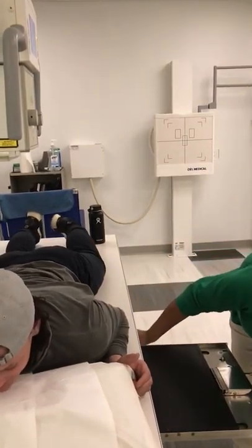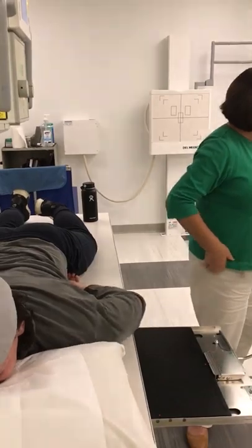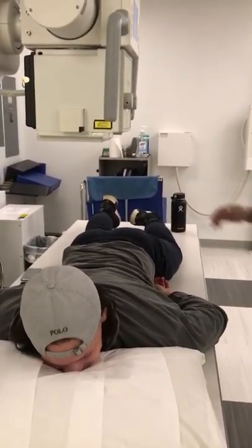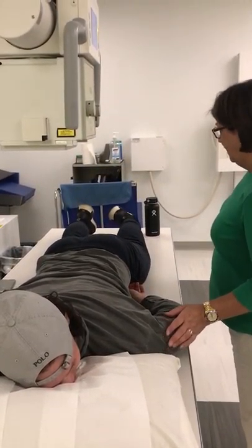I'm not that even. So I need to check that to make sure that the top of the IR is at the top of the shoulder, 2 inches above the top of the shoulder. RAO.